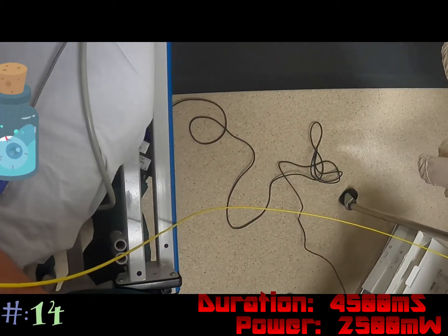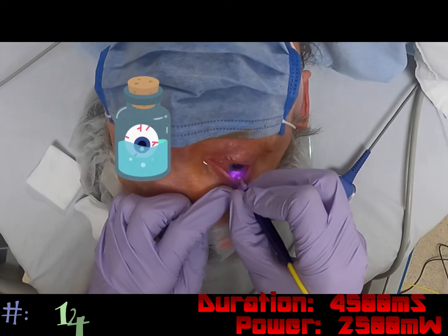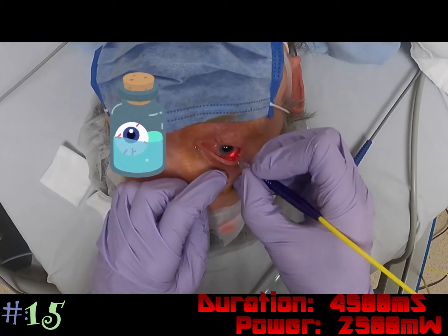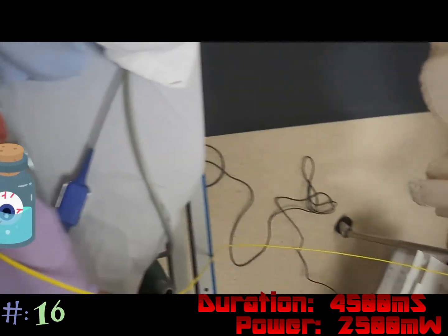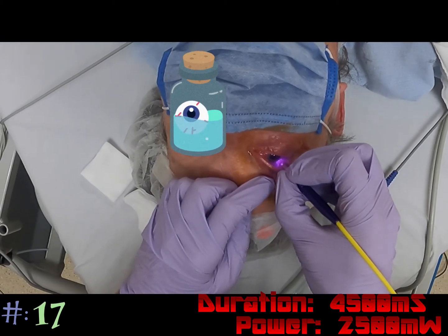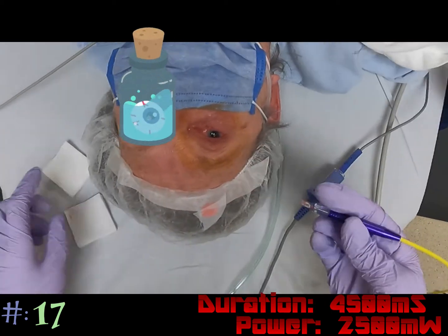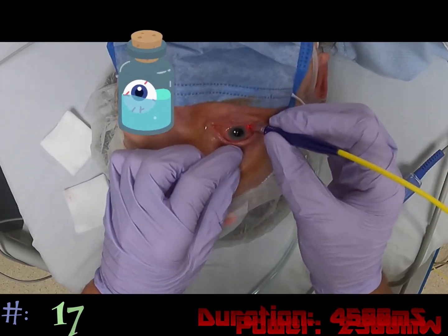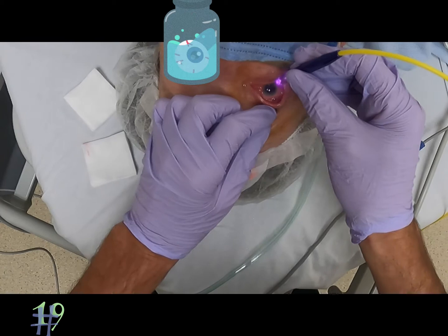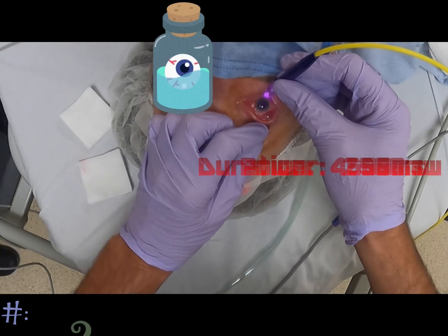You can usually get in somewhere around 15 to 18 spots in that first row, then fill in the rest about two to two and a half millimeters away from the limbus as a posterior row. She has a little bit of subconjunctival Canalog — I do that two days beforehand to help with the healing process and make it easier on the patient so they're not having to use drops as frequently. I do still keep them on topical drops though.